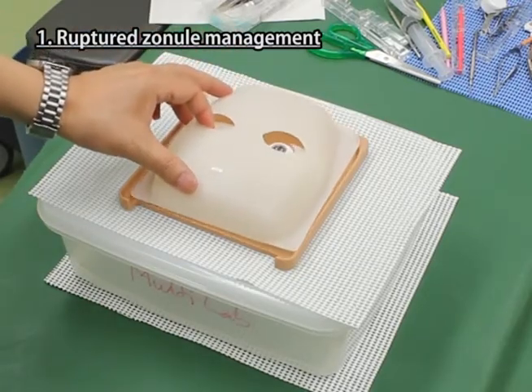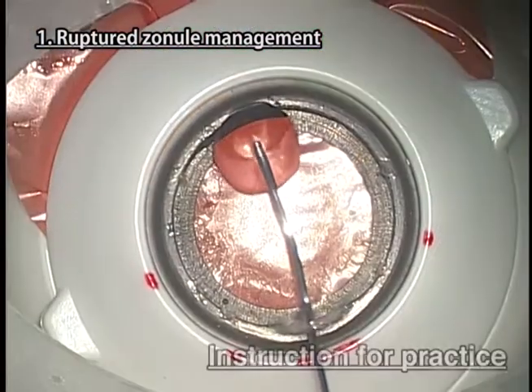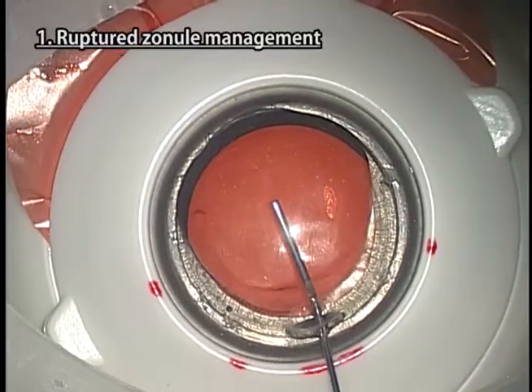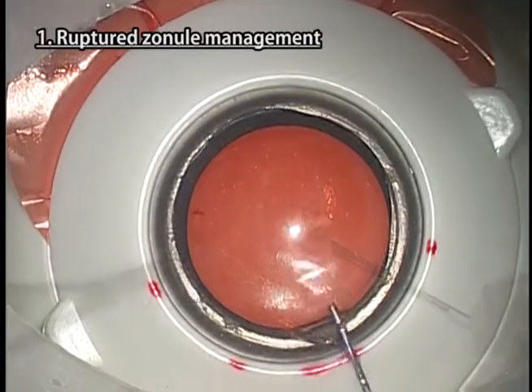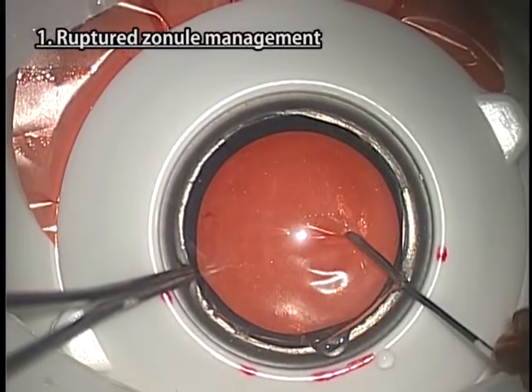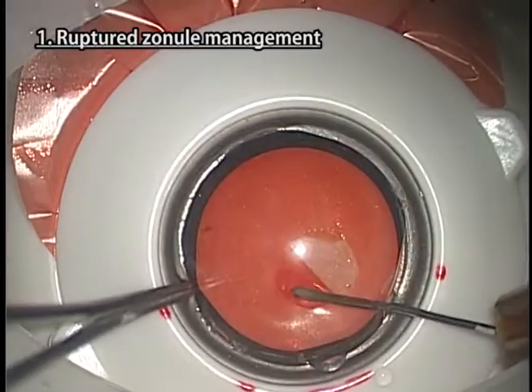Then cover the base plate with the mask and keep it closed from the bottom.